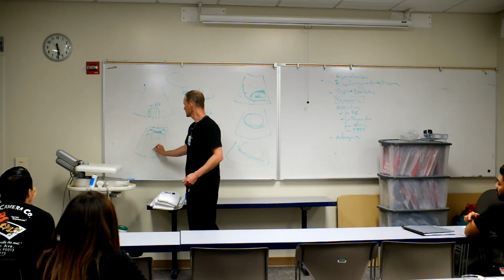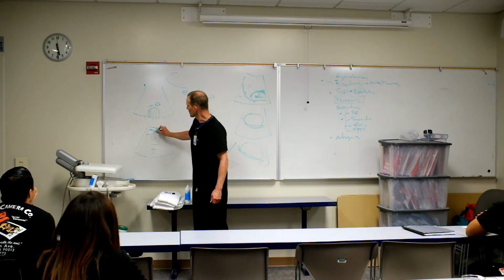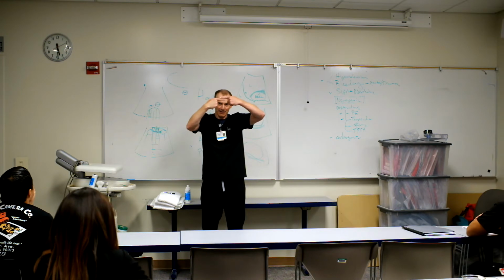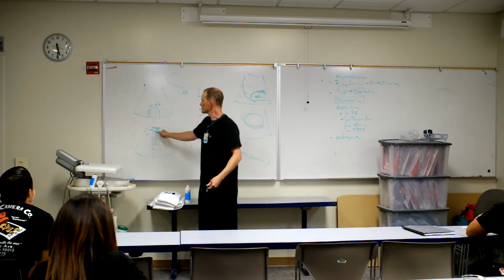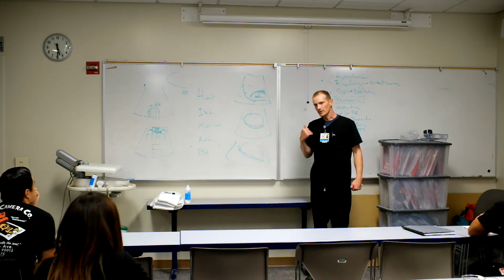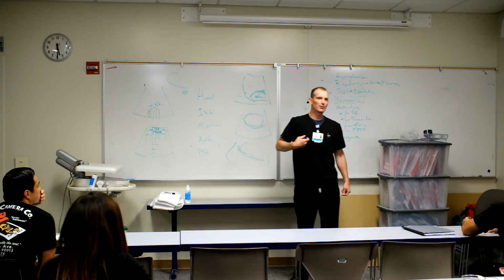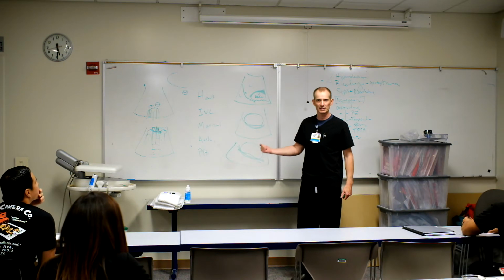So what you would see is your A lines, just like a normal lung exam, except with no sliding. Because you still get this back and forth reverberation artifact with just an air interface here. But the difference is that the pleura is not sliding, so you're not seeing the pleura around the lung, just the pleura on the chest wall. Okay, so A lines with no sliding is a pneumothorax. If you have a pneumothorax that's big enough to cause them to go into shock, then you'll see it if you just scan these, a quick 1, 2, 1, 2, anterior mid-axillary line. A real tiny 5% pneumothorax is not causing them to be hypotensive, right? These are large pneumothoraces that are causing it.